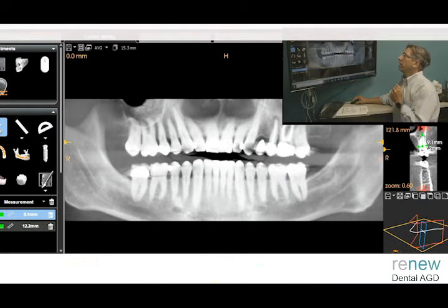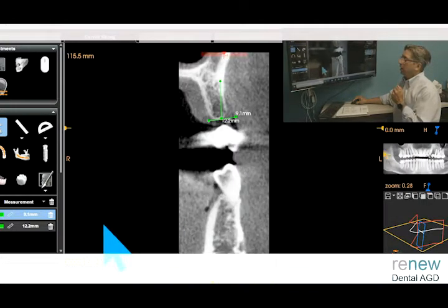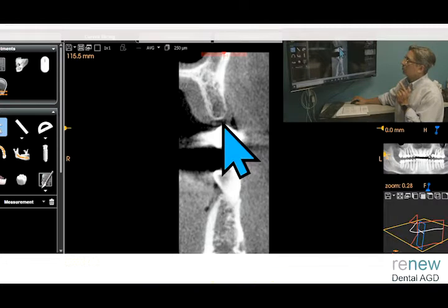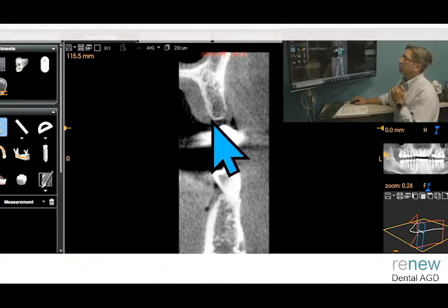Now, the area next door where the cantilever is a pretty nice site. Not super wide, and not super dense of bone, but I'm okay with that. That's what it looks like. So it's not so dense here. So what's nice about this as a starter one is once you break through that cortical layer, it becomes very easy to get that first initial burr in there, and you've got plenty of room to go. You have nice walls to deal with.